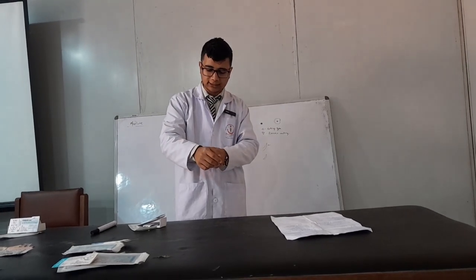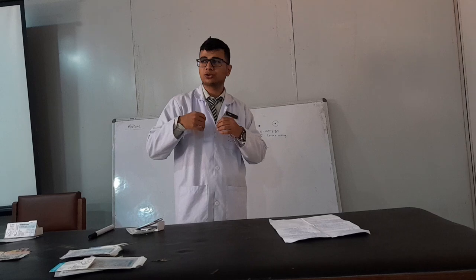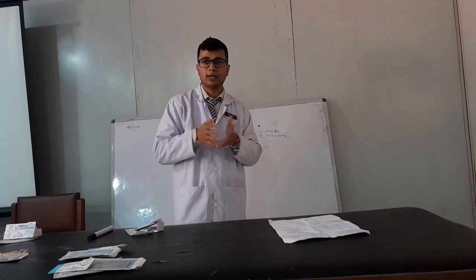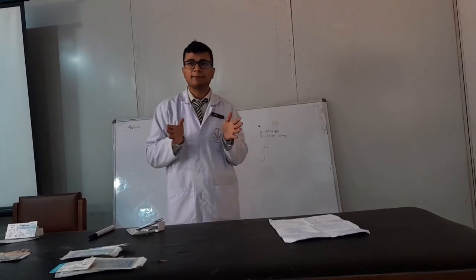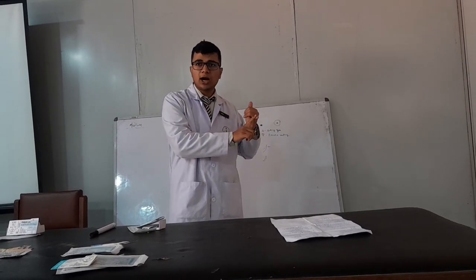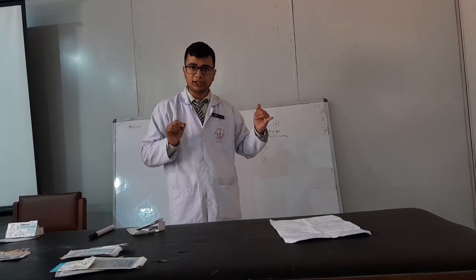Like if I take the example of my suture, it can be monofilament, like a smooth one. But if you say sweater, woolen clothes, they will be having multifilament. So we need to understand the basic fundamentals of why we can separate these two different categories. The monofilament one is smooth in nature, however, multifilament is rough in texture.